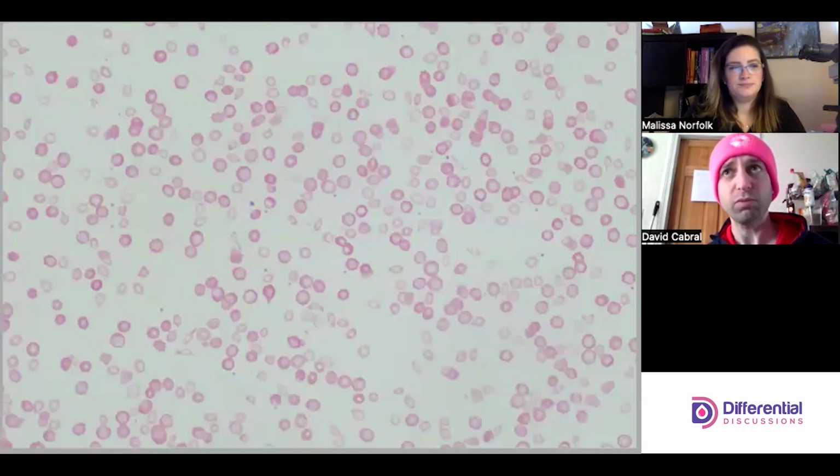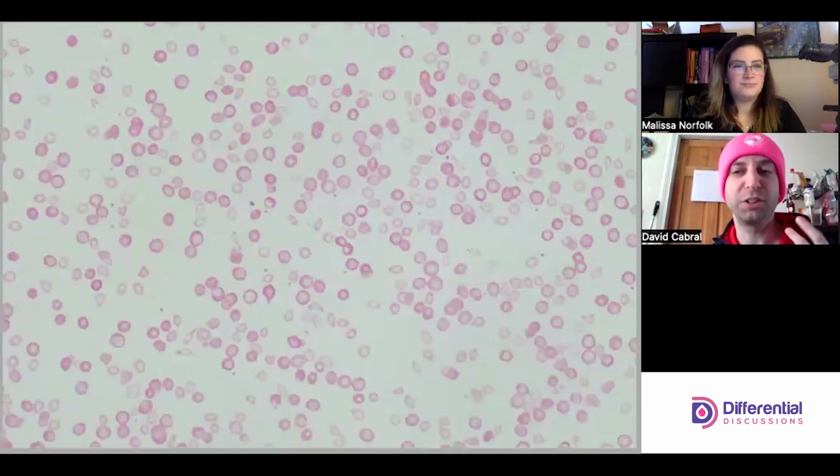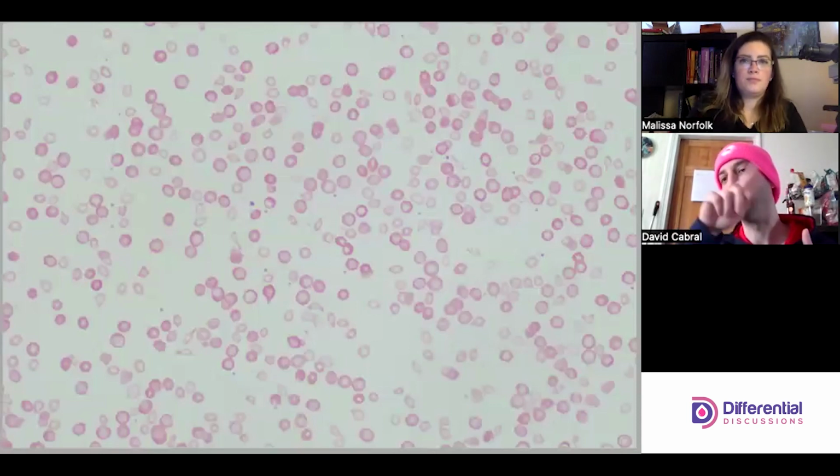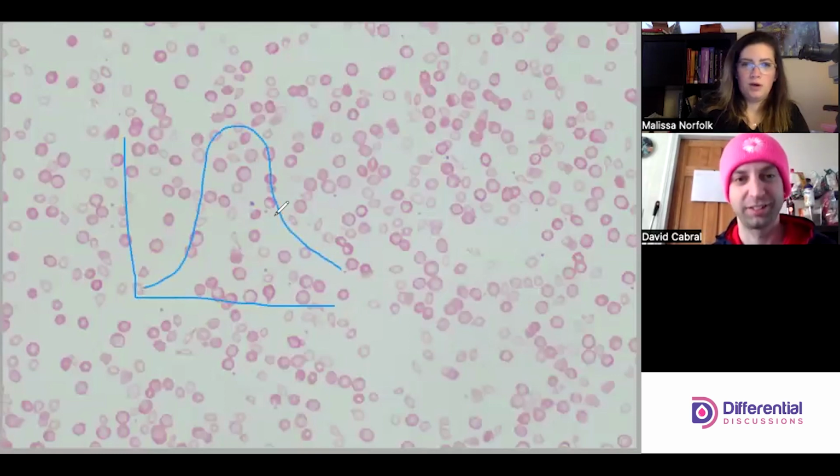You'll see a crazy high RDW or no RDW at all, depending on the instrumentation and how different the populations are. But the most visually attention grabbing would be the histogram on the red cells. They should show two, maybe not perfect Gaussian bell curves, but two distinct bell curves representing those two different populations. Let's draw it. Normally you see something ideally like this, a little bit further down, but something like that.